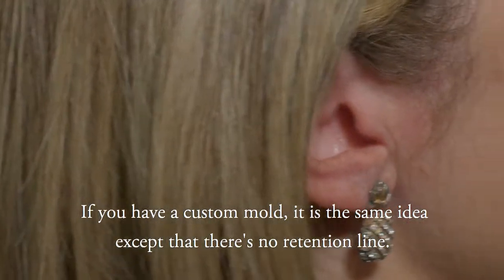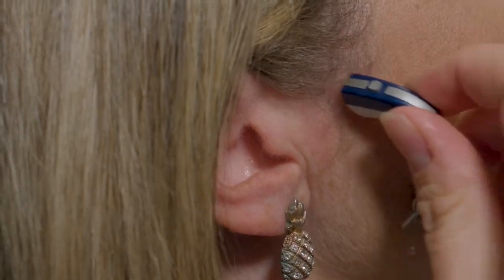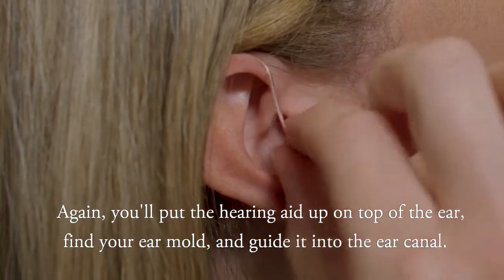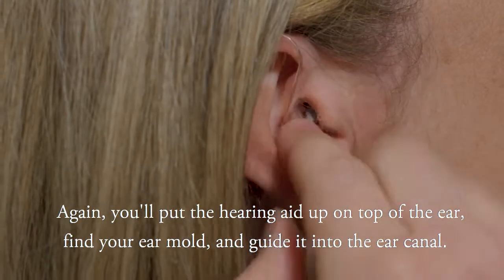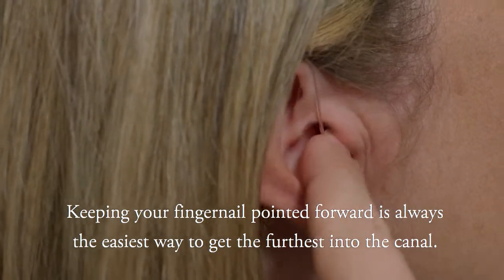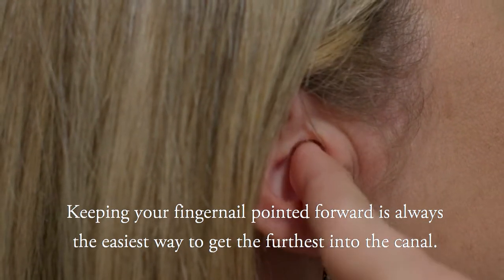If you have a custom mold, it is the same idea, except that there's no retention line. Again, you'll put the hearing aid up on top of the ear, find your ear molds, and guide it into the ear canal. Keeping your fingernail pointed forward is always the easiest way to get the furthest into the canal.